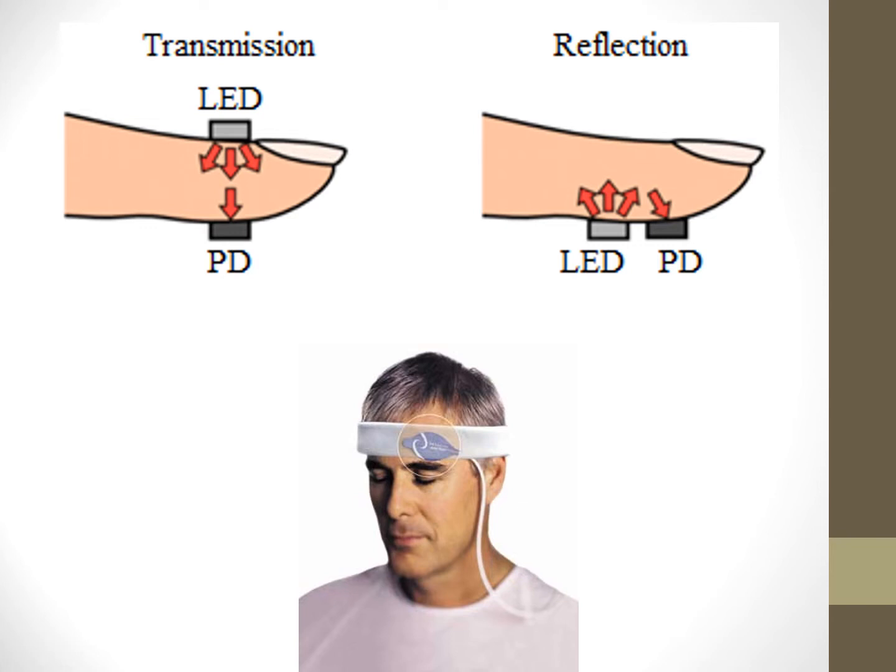With low blood pressure, vasoconstricted extremities, or patients on pressors, we might get way better accuracy with a reflective pulse ox or forehead probe than with a finger probe that's transmission related. So please understand those differences, especially in critical care medicine and in adult medicine. That reflective probe is going to be awesome for you.